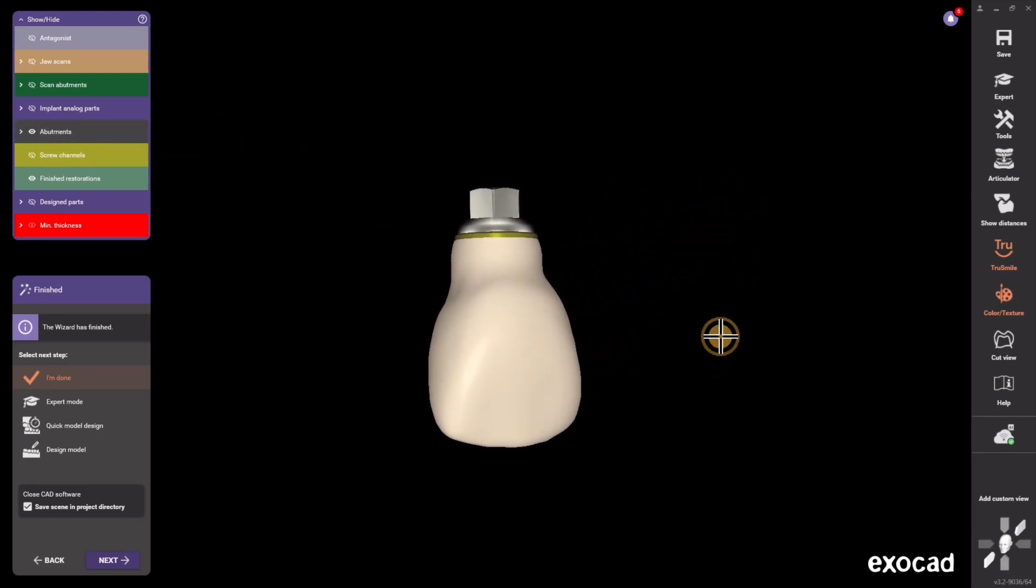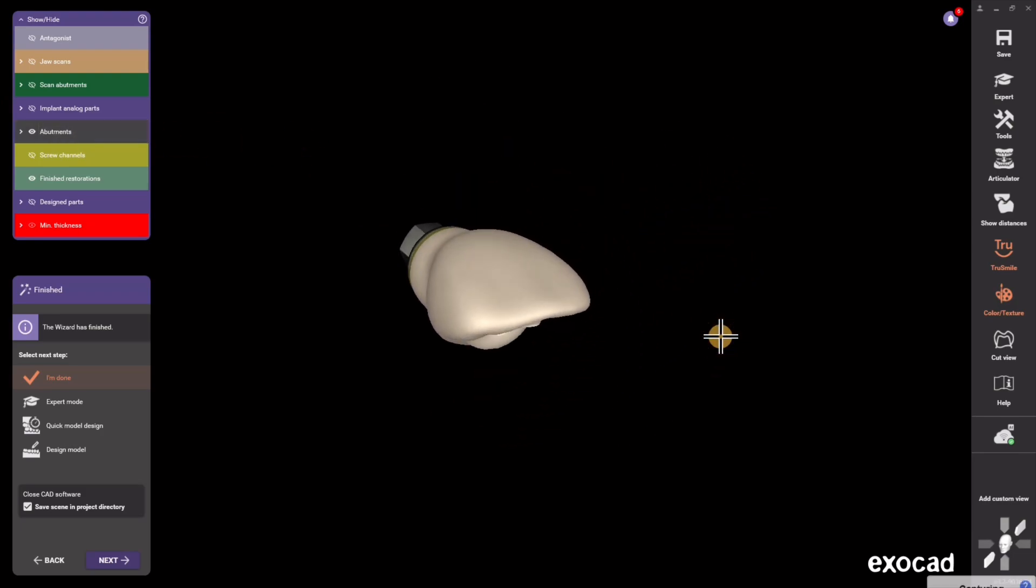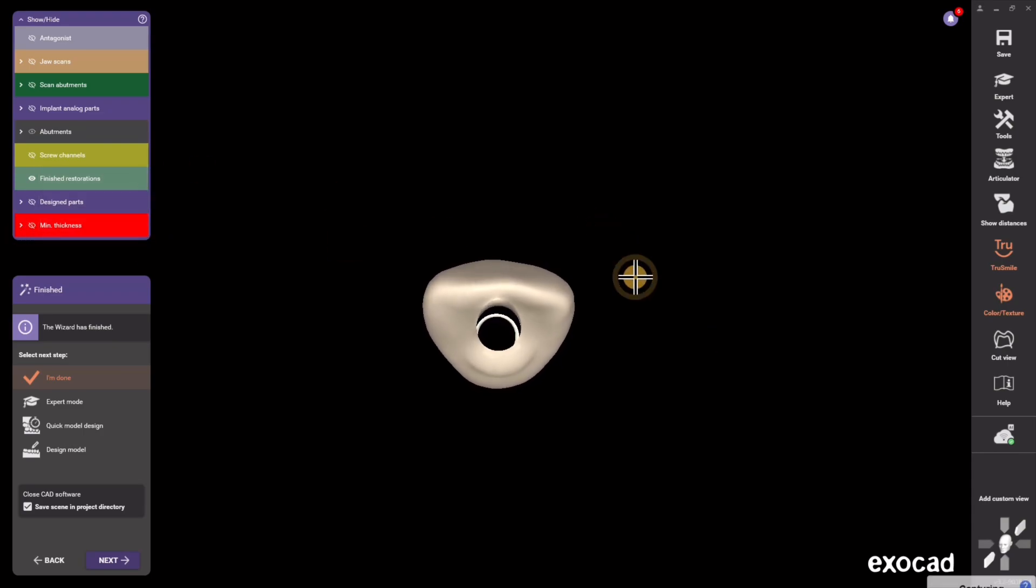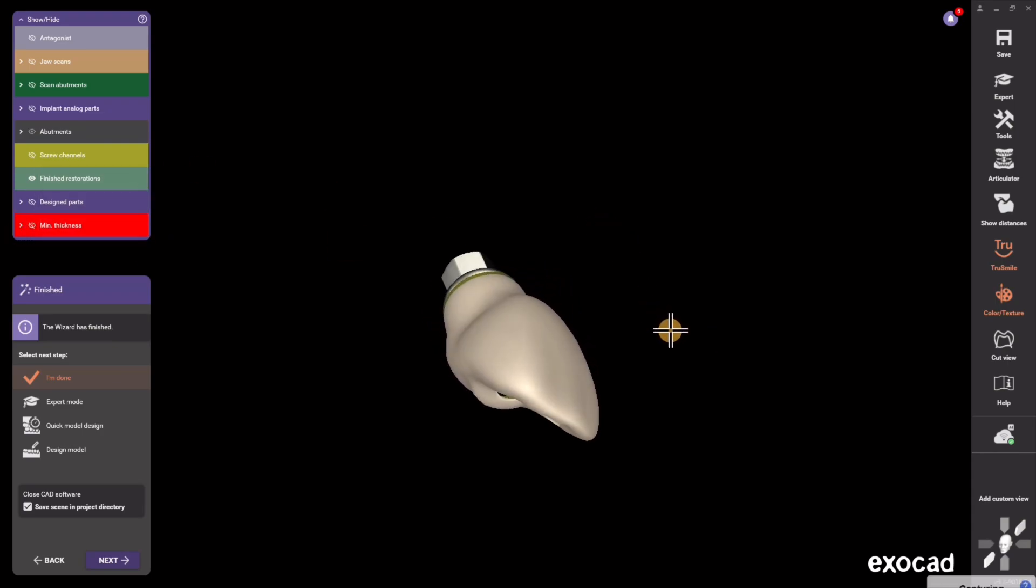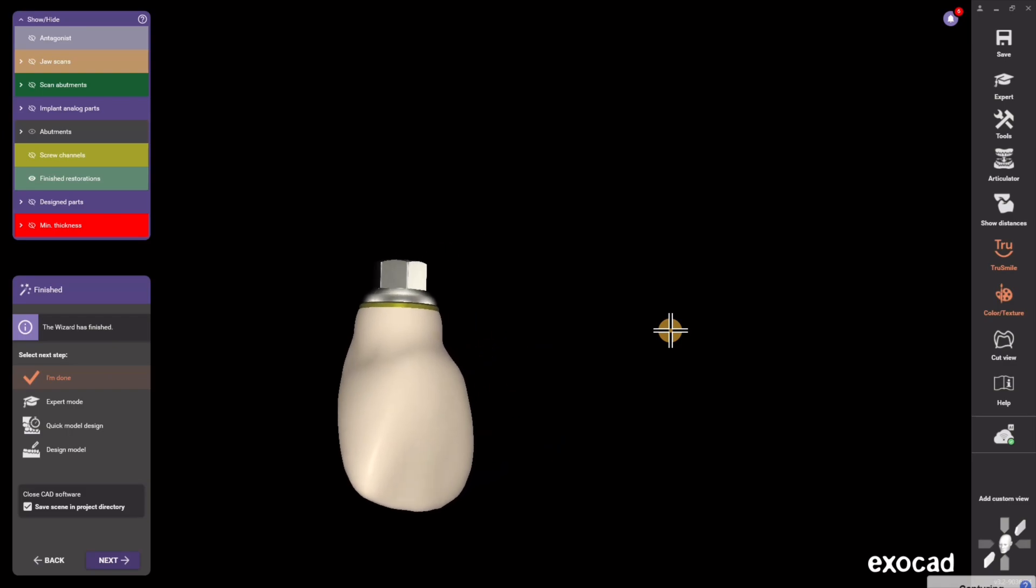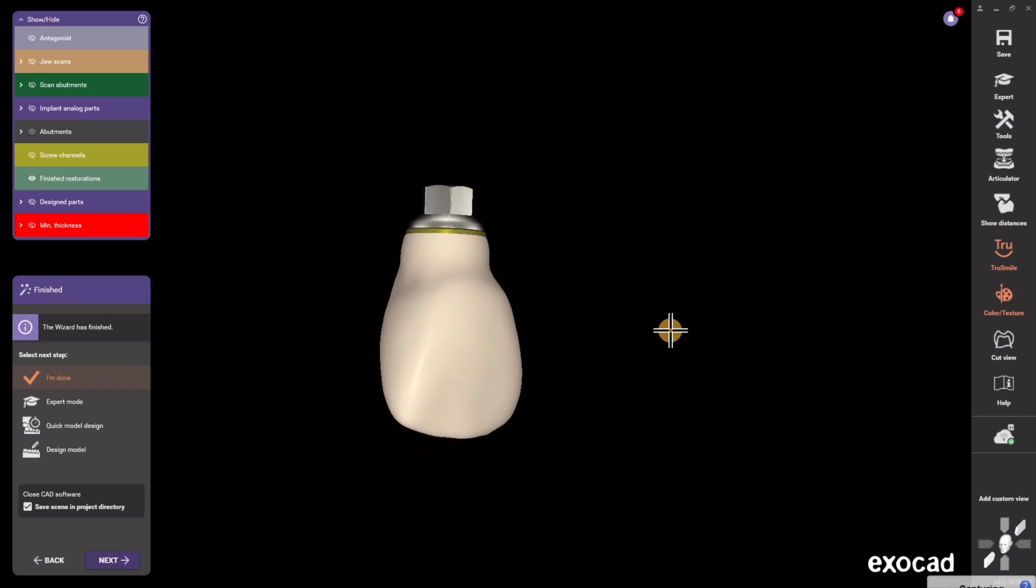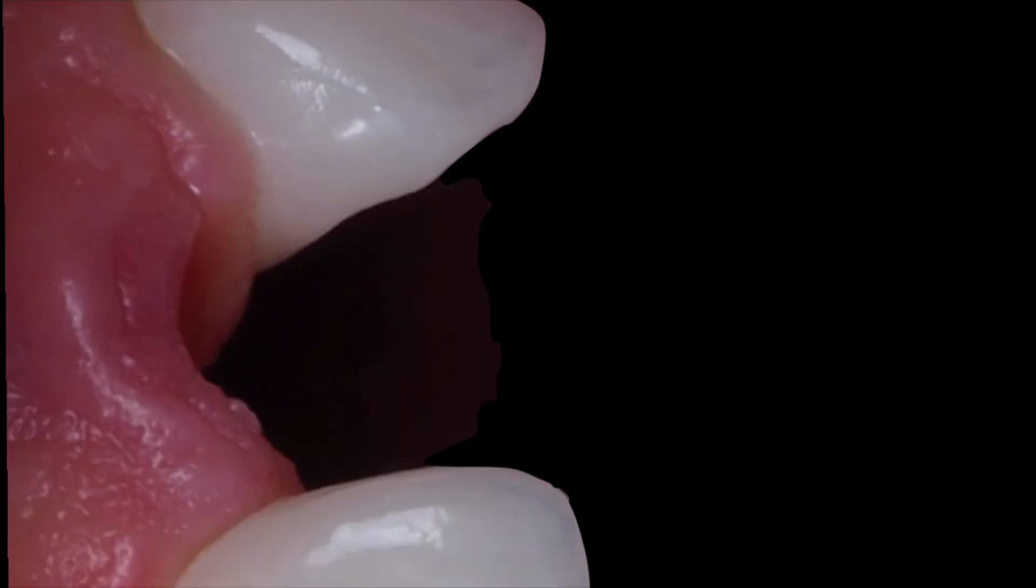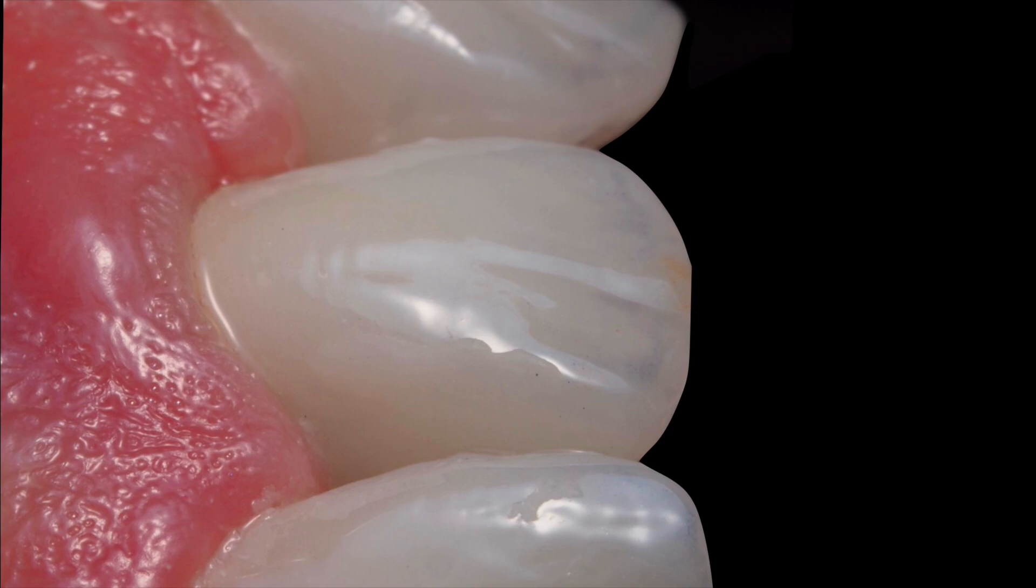So this is implant crown design in a nutshell. Let me just remove my min thickness so you can see the screw hole right there. So that will get printed or milled and then bonded onto the tie base and screwed into the mouth just like this.